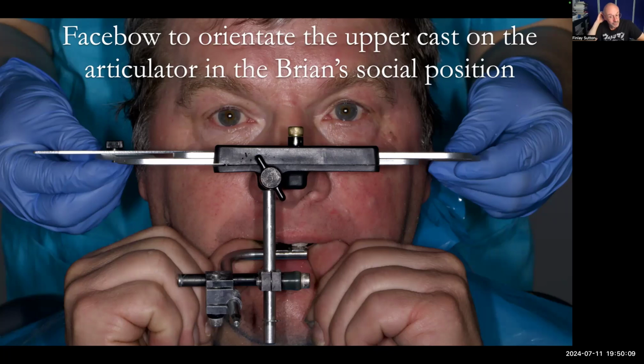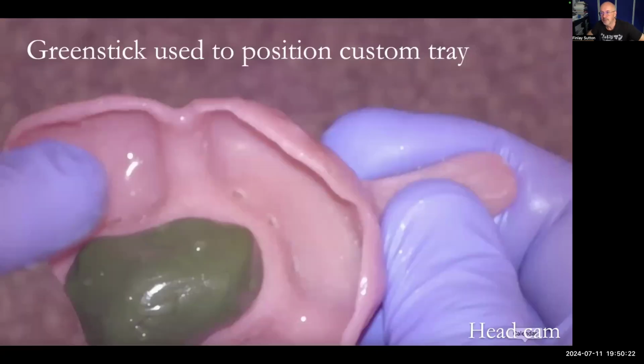But I think the most important instruction about a special tray is, and I'm just going to quickly go back to the tray itself, like this, and this is really important, Alexandra, that the technician doesn't make it so that the tray touches the teeth. There must be plenty of space there, and Rowan will often put 3 or 4 layers of wax over the teeth whilst he's making a special tray to give space. So that's super important.